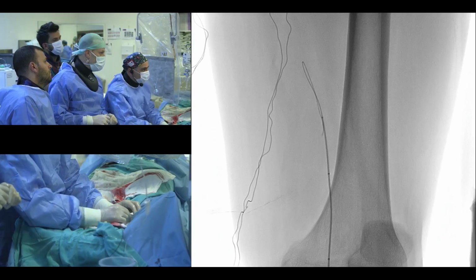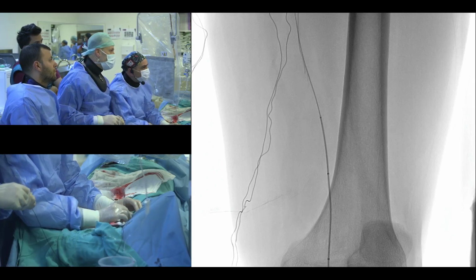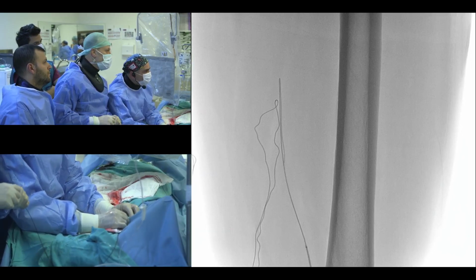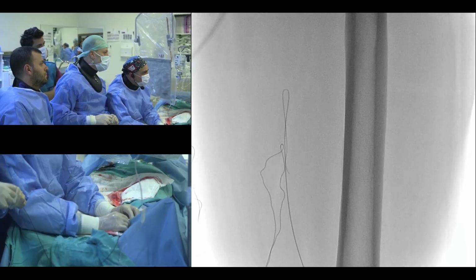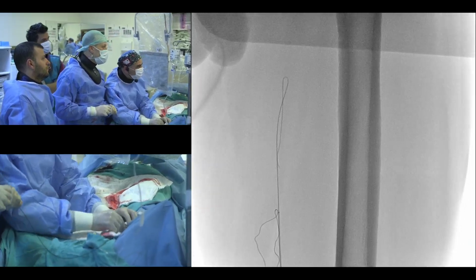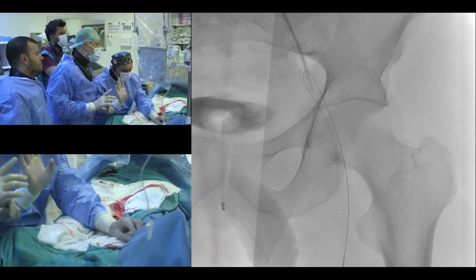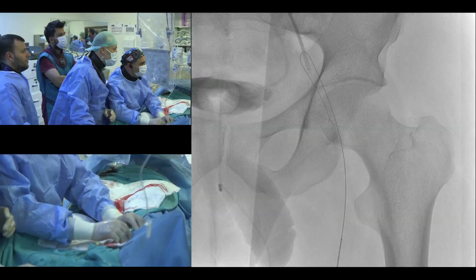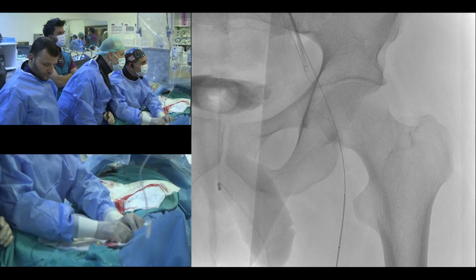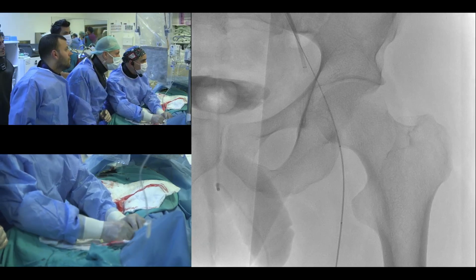035 wire Roadrunner to gain advancement. The wire tip loop should not be bigger than the vessel size. Roadrunner is really an excellent guide wire, but in this stage we selected a loop guide wire instead of a stiff one. Geçtik herhalde.